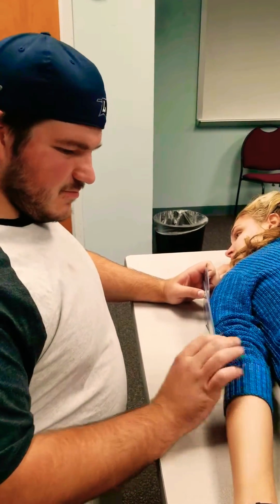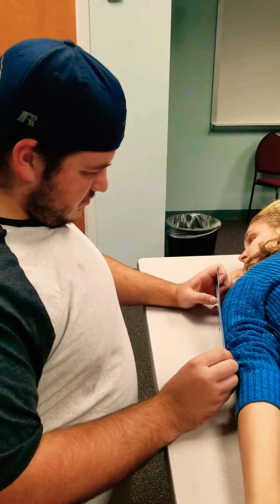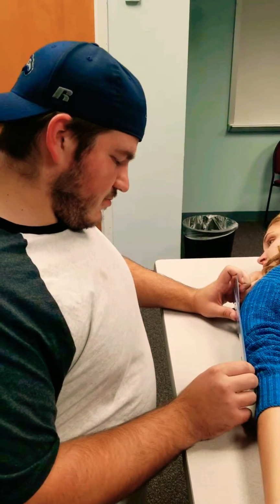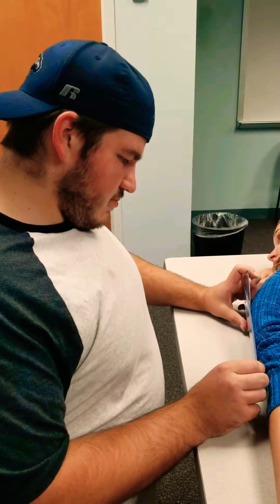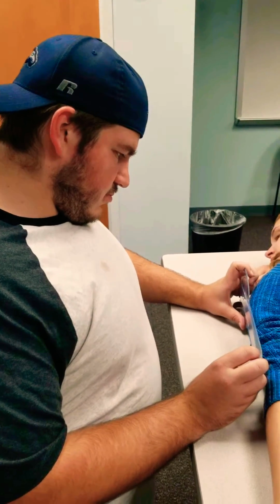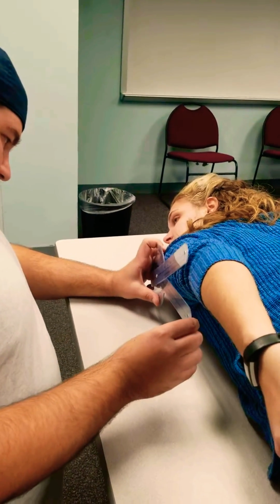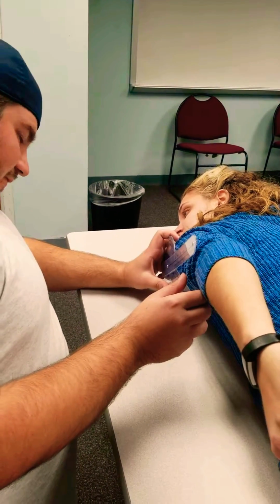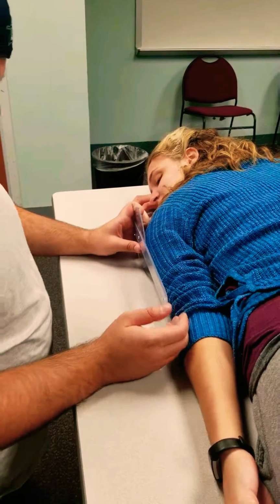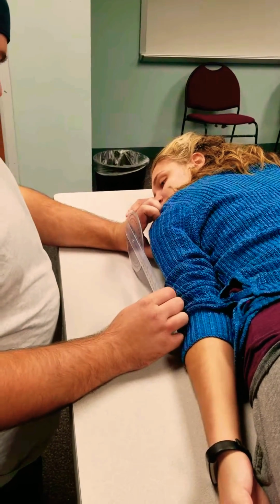The landmarks that we're using: the center is on the lateral aspect of the greater tubercle. The stationary arm is at the mid-axillary line of the thorax, and the movement arm is on the lateral condyle of the humerus. The first range of motion that we're going to test is active. The next range of motion that we're going to do is passive range of motion of extension.